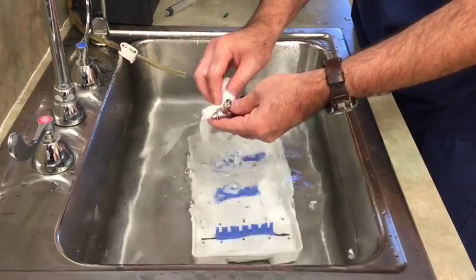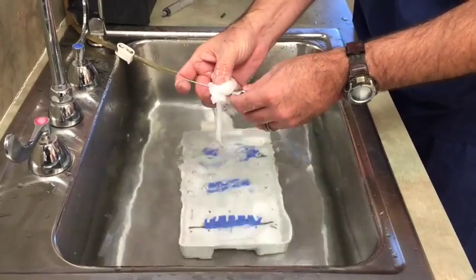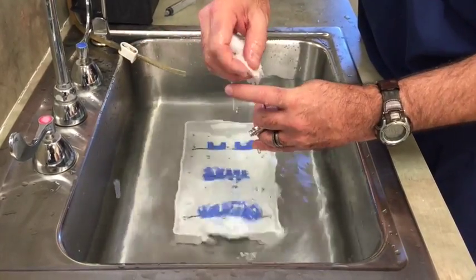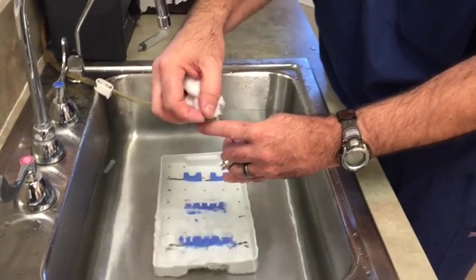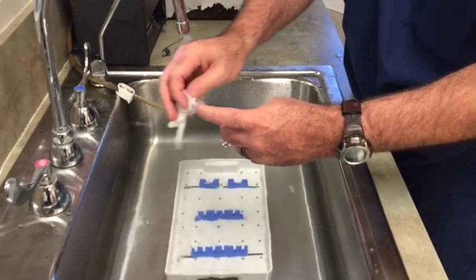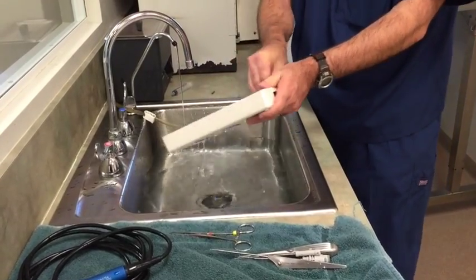Just like with the lens on the camera, the ETO can leave a film buildup on the lenses, so we want to carefully wash those. This lens on the tip — we want to carefully, just gently — we don't want to put any pressure on the actual scope itself, but we do want to make sure that lens gets good and clean.